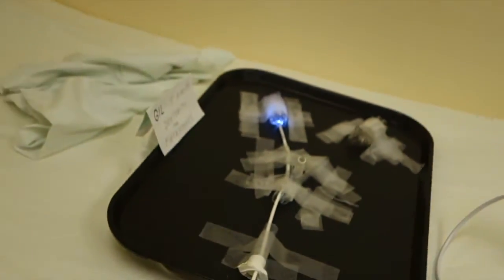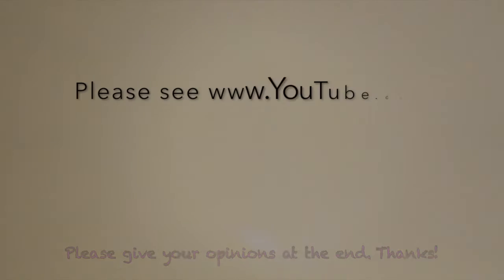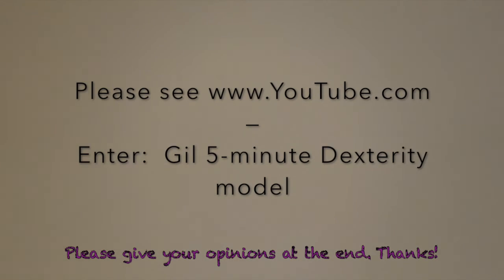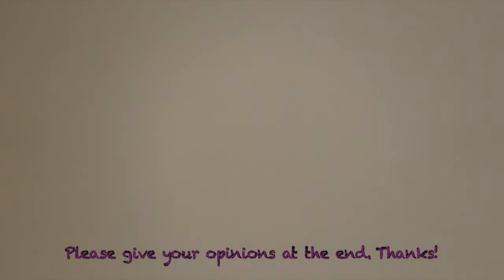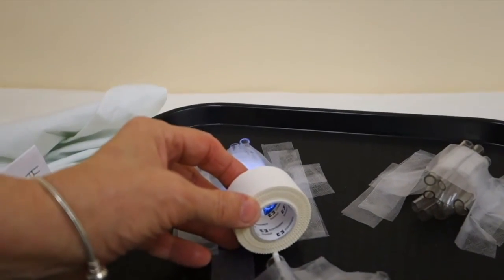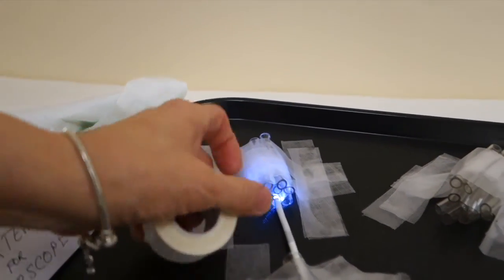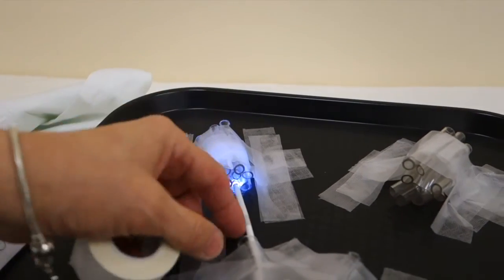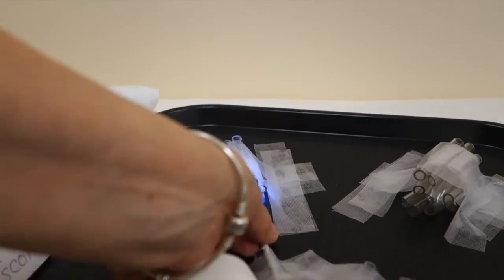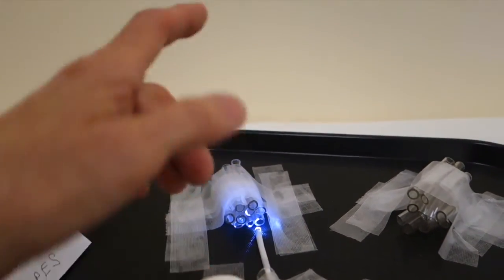I'm going to turn the lights on. To make it more difficult, you can put anything you want next to one of the elements of the course, causing a slight deviation to the left or right, or put something underneath the course so that your fiber scope has to go from an upper direction to a lower direction.